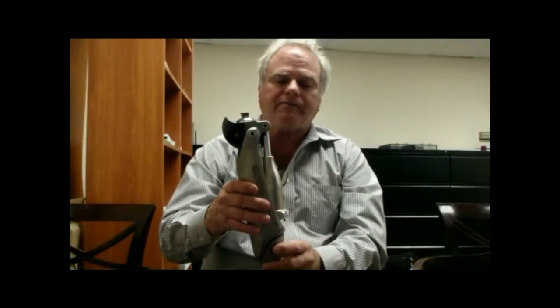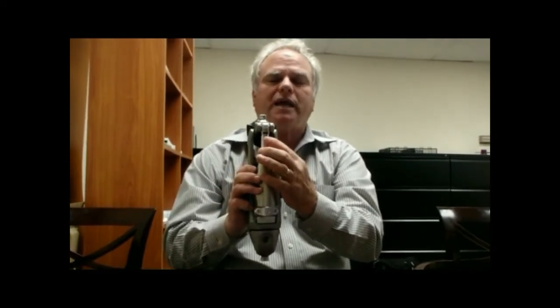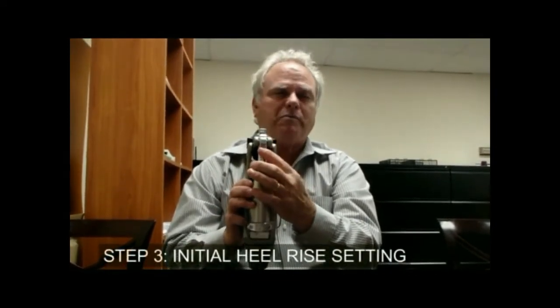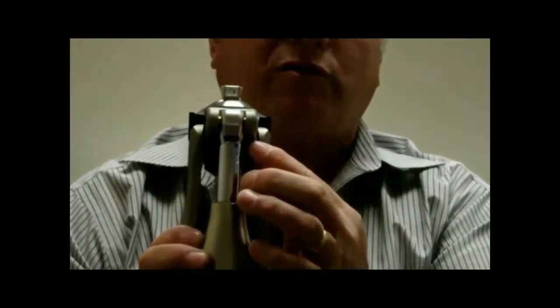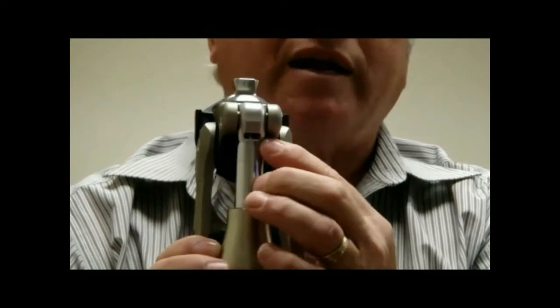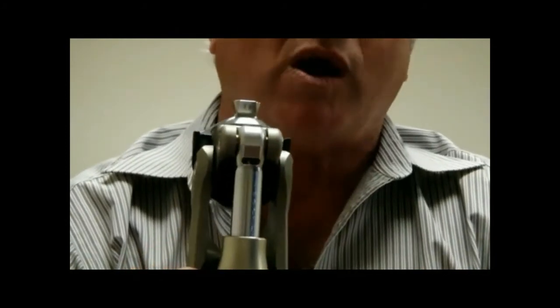Step number three is to reduce the heel rise, or to make it have more heel rise. Most people start off with this lever slid all the way over to the right side as you look at it. It's right up here, slide it to the right. It comes out of the box that way, but just in case, slide it all the way to the right before you walk your patient.